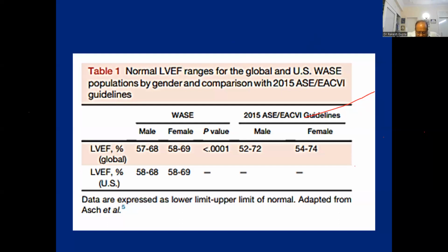Okay, don't get confused. When is the LVOT maximum in size? When the LVOT or aortic valve leaflets open. During diastole or systole? Systole. Correct. So we do the LVOT measurement in early systole.